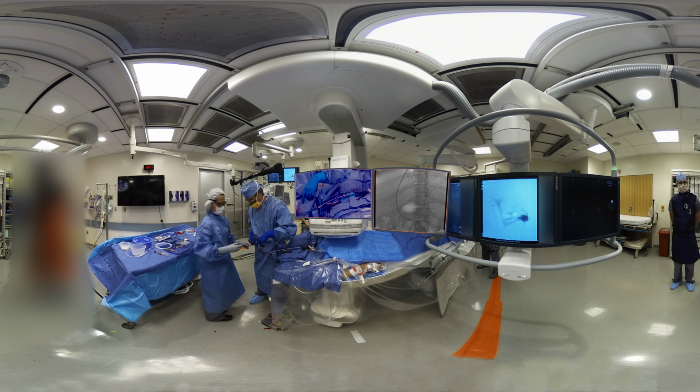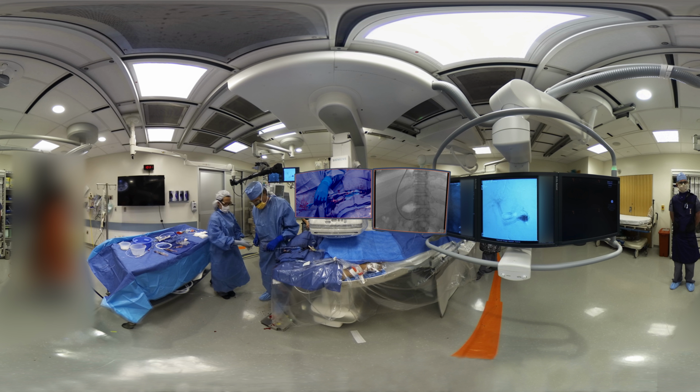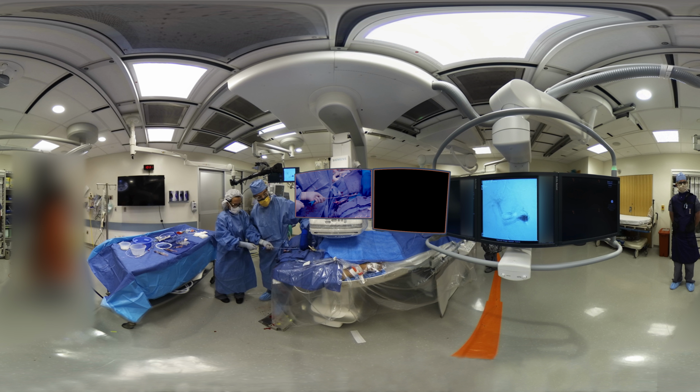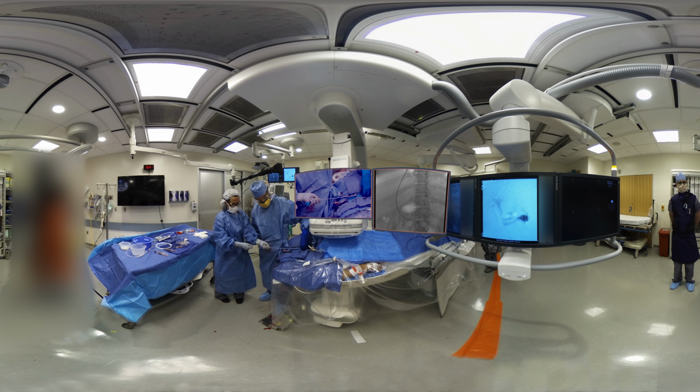Okay. So if you'll just, here, you can stand over here and back the two out over here. Yep, exactly. Okay. Pinch pull.